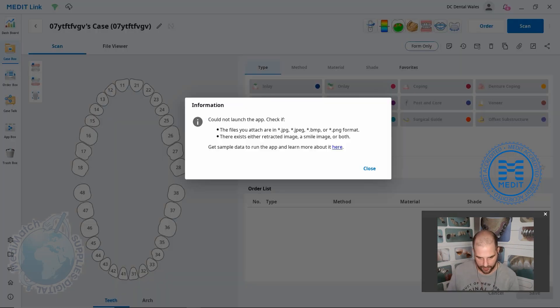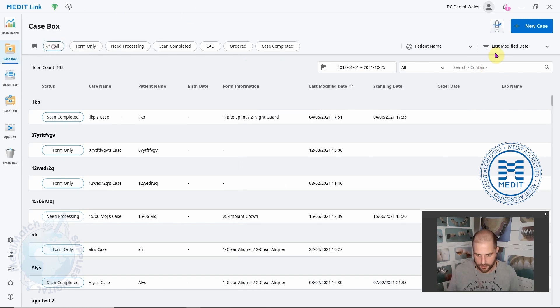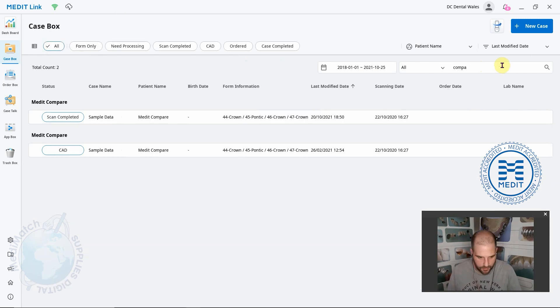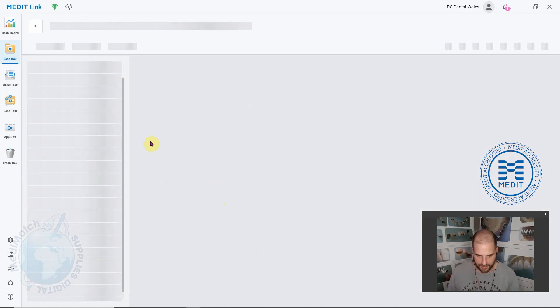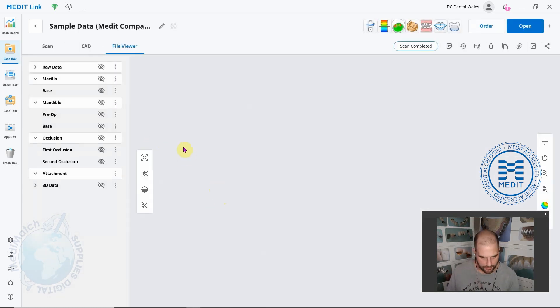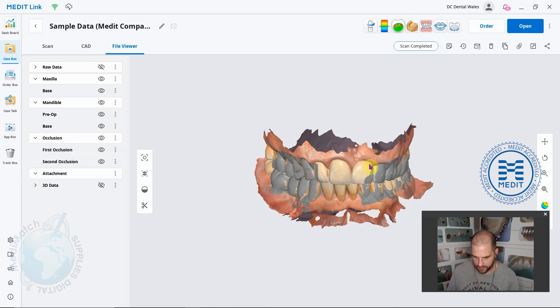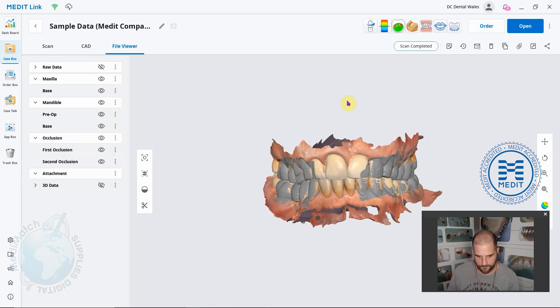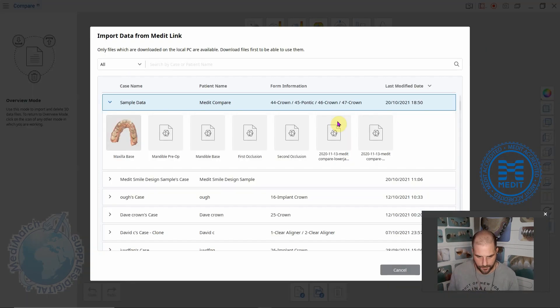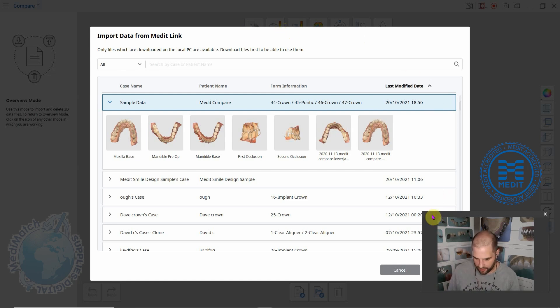Let me go back into here. This is the sample data that you can download. I'm just going to click on the Compare app up here.